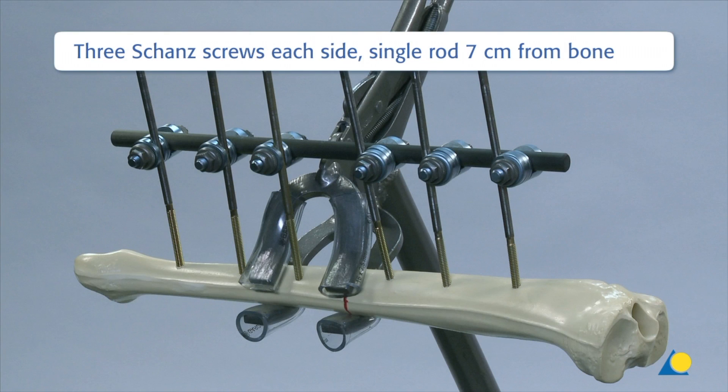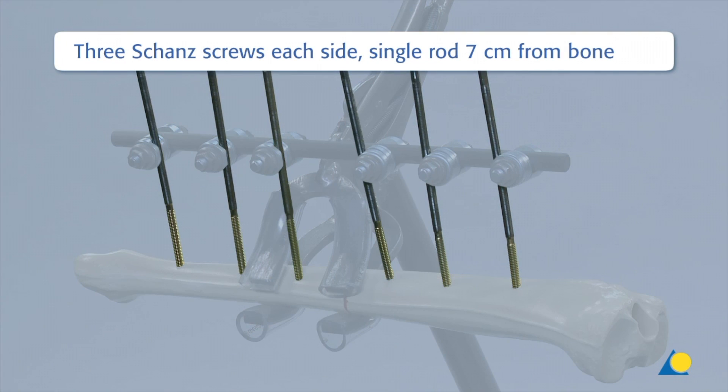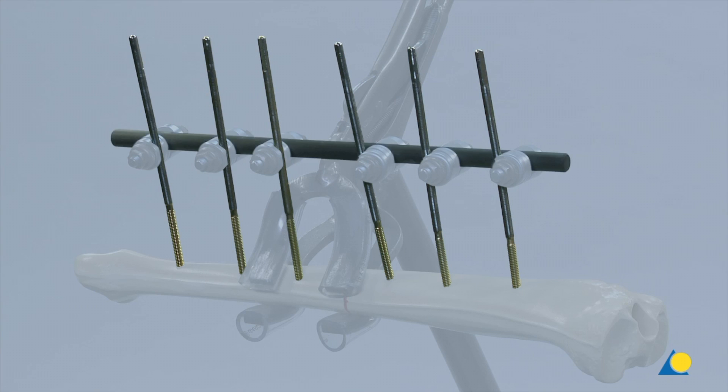In this single rod construction, three Schanz screws are placed on either side of the fracture. The rod is placed 7 cm from the bone and secured with six large open self-holding clamps.